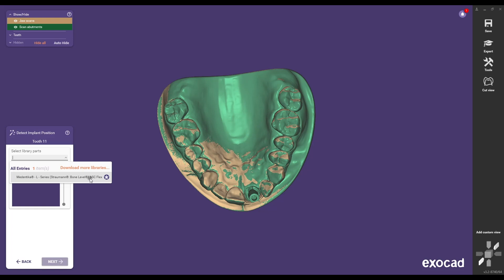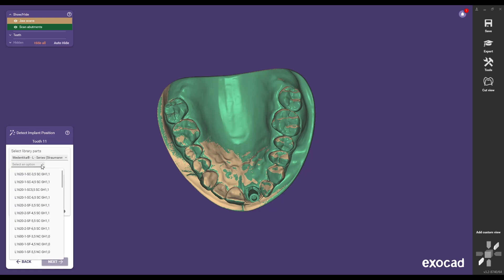Choose the article code and corresponding abutment height of the Titanium Base ASC Flex. In this example use L16101SF with an abutment height of 4.5 mm compatible with the RC implant interface.